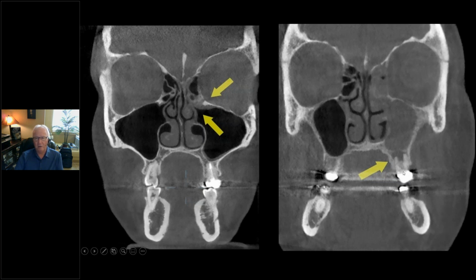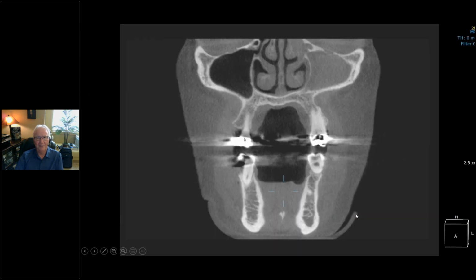This tooth has to be removed. This stuff has to be removed. It's blocked the ostium and blocked up the ethmoid air cell complex. This guy's probably got unilateral facial pain, referred pain, dental pain, all of the above. This is a combo endodontist ENT patient before you do the implants. Just think of it as pre-prosthetic planning or pre-surgical planning, okay?